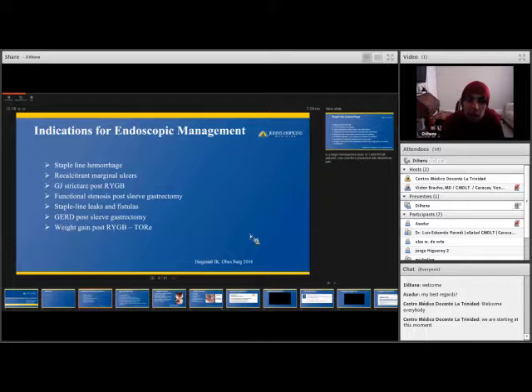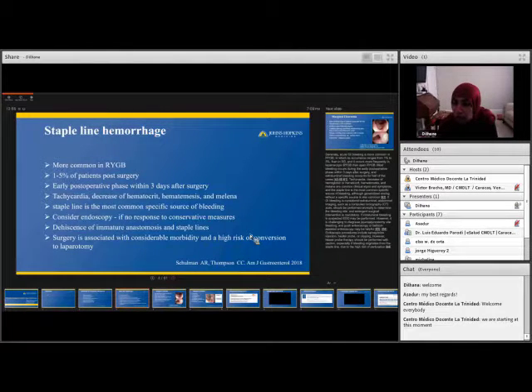So today I'm going to present on endoscopic management of bariatric surgery complications. I have no relevant disclosures. The things we're going to talk about today are the indications for endoscopic management. We see a couple of things: staple line hemorrhage, recalcitrant marginal ulcers, gastrojejunal strictures after Roux-en-Y gastric bypass, functional stenosis after sleeve gastrectomy procedures, staple line leaks and fistulas, which can be quite difficult to manage, as well as GERD post-sleeve gastrectomy, and weight gain post-Roux-en-Y gastric bypass.